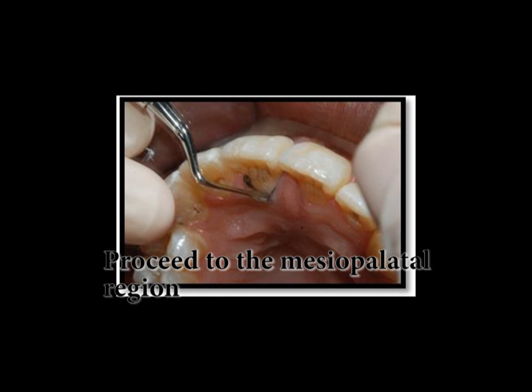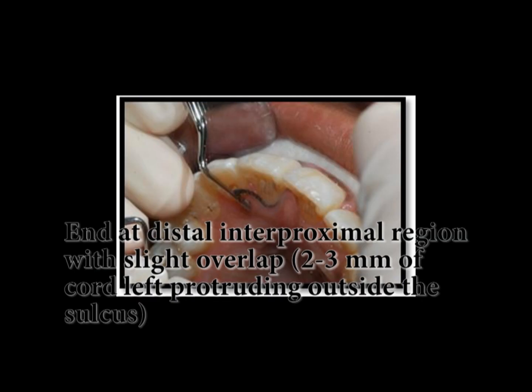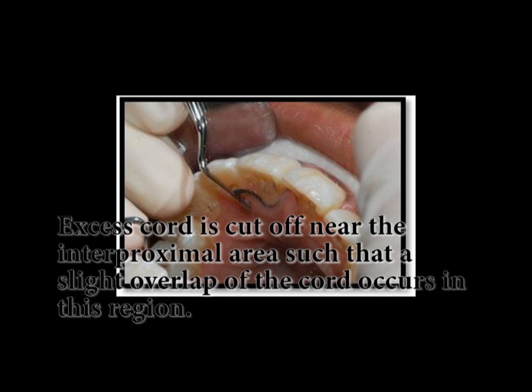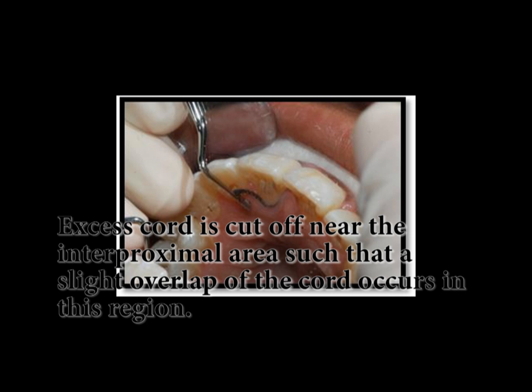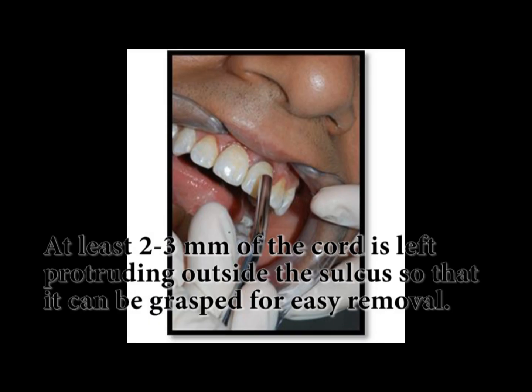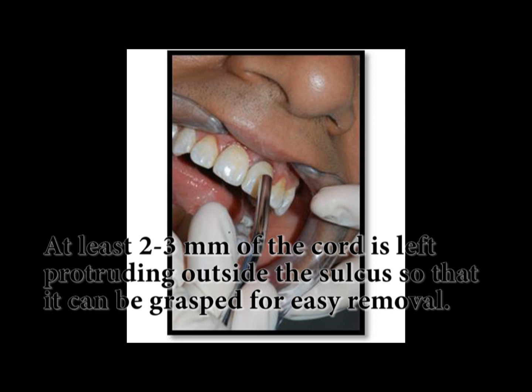Proceed to the mesio-palatal region. End at the distal interproximal region with slight overlap, two to three millimeters of cord left protruding outside the sulcus. Excess cord is cut off near the interproximal area such that a slight overlap of the cord occurs in this region. At least two to three millimeters of the cord is left protruding outside the sulcus so that it can be grasped for easy removal.